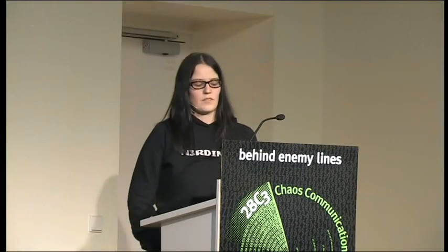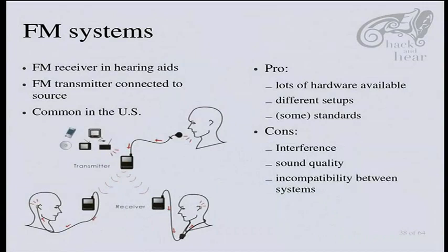Another very common technology is FM systems. You can buy those from several vendors. You have receivers and transmitters. They have different setups, like for a meeting, where you can put a microphone on the meeting table and hear all the participants talk, or for lecture halls, where you can connect the microphone to the transmitter and listen to it.